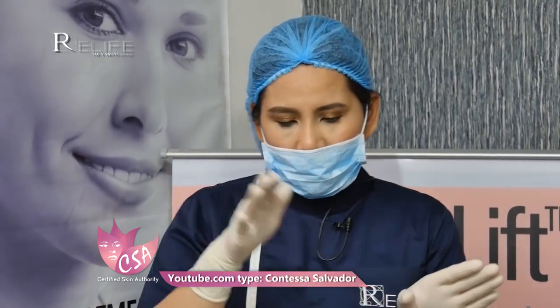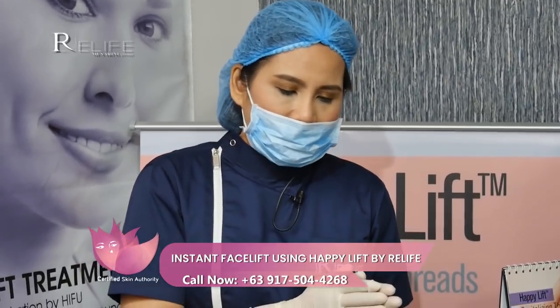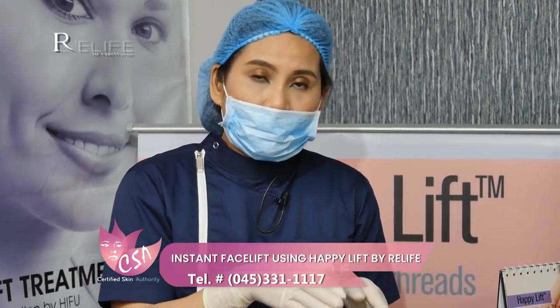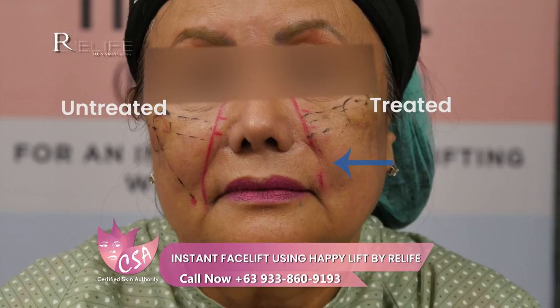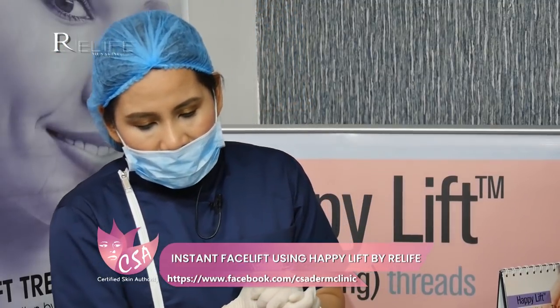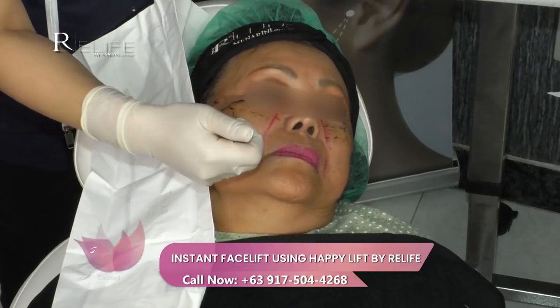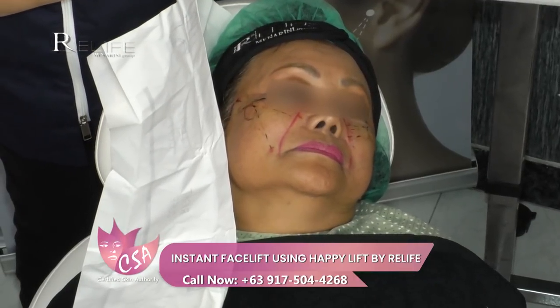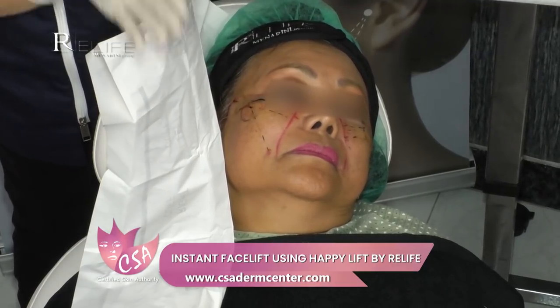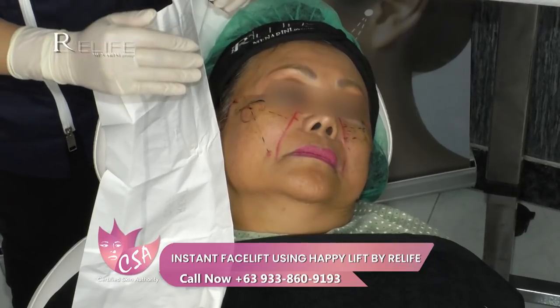We are back and proceeding to the right side. We did the Happy Lift revitalizing threads on the left side and will now continue on the right side. We've already noticed a decrease in the nasolabial fold on the left side — the treated area compared with the untreated area shows an immediate lifting effect. As a review, we have two safety lines: the first from the lateral canthus of the eye to the tragus of the ear, and the second from the medial canthus to the modiolus. Safety lines must be marked to avoid vital structures.